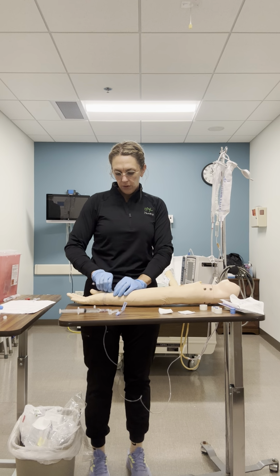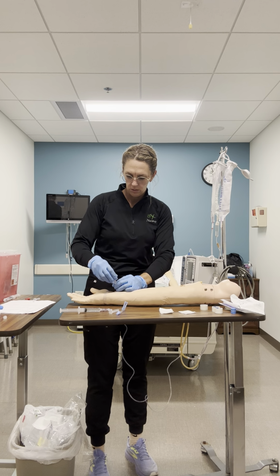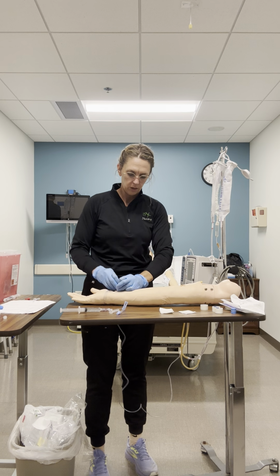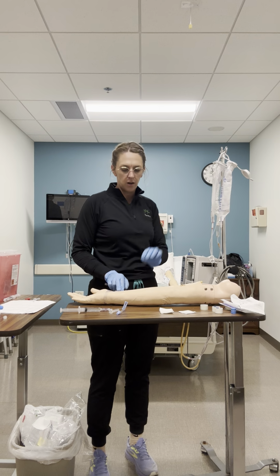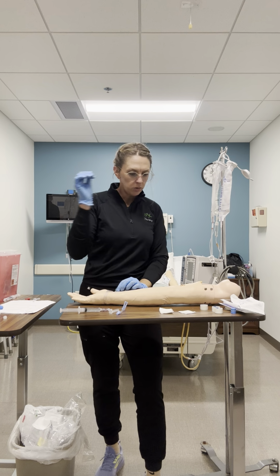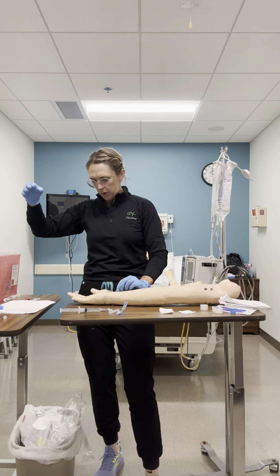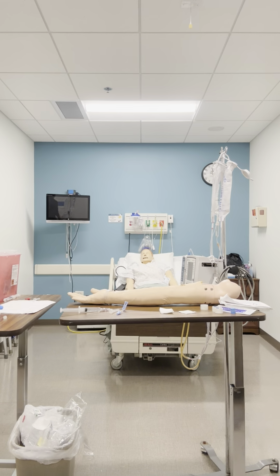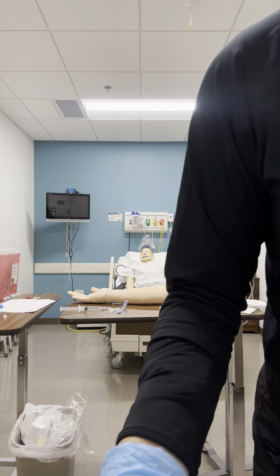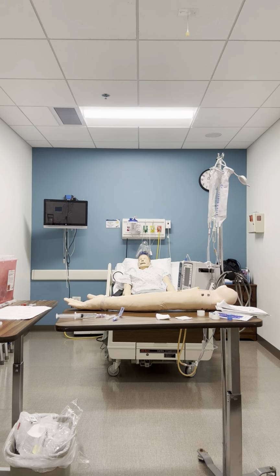I'm going to remove the IV tubing. That fits very loosely, but that's okay. I'm going to remove that for now. And then I'm going to take my alcohol prep pad, which should be over here. So I'm just going to grab one because I have one and now I don't. My apologies, the phone fell. Okay, just grabbing these.